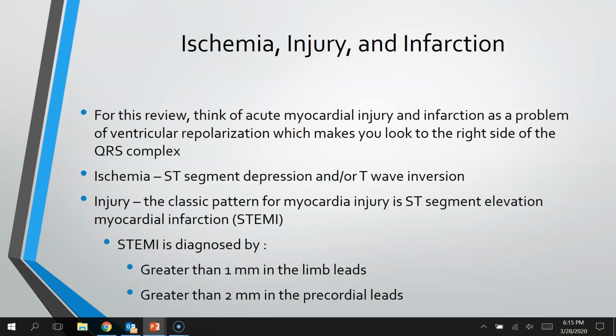Some different terminology when we look at the segments and intervals. Again, we talked about ischemia. If we see an ST segment depression, or if the T wave is inverted, instead of a positive deflection it's a negative deflection, we can look at that and assume there may be some type of ischemia.